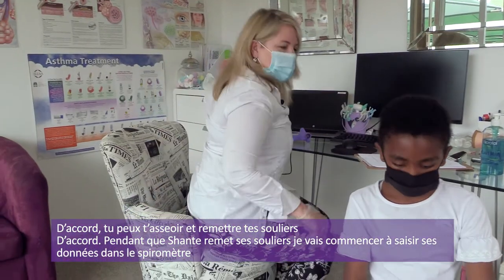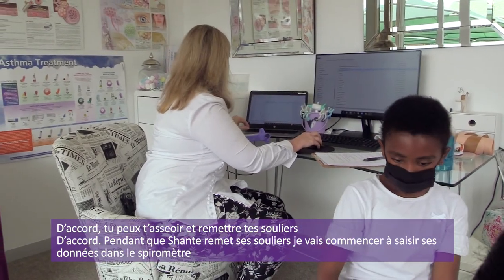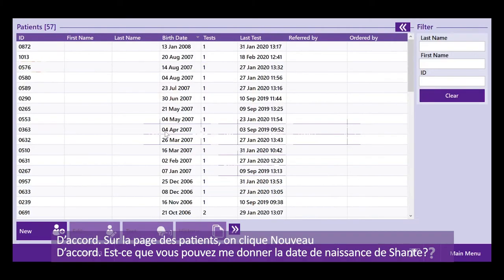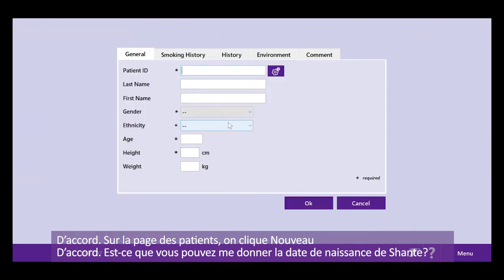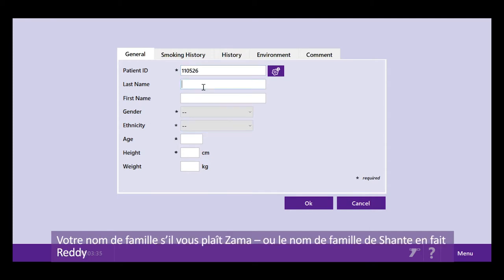All right, so while Shanti's putting her shoes on, I'm going to start entering her details into the spirometer. All right, so we come to patients. We come to new. Okay, could you please give me Shanti's date of birth? She was born on the 26th of May, 2011. Thank you. Your last name, please, or Shanti's last name.